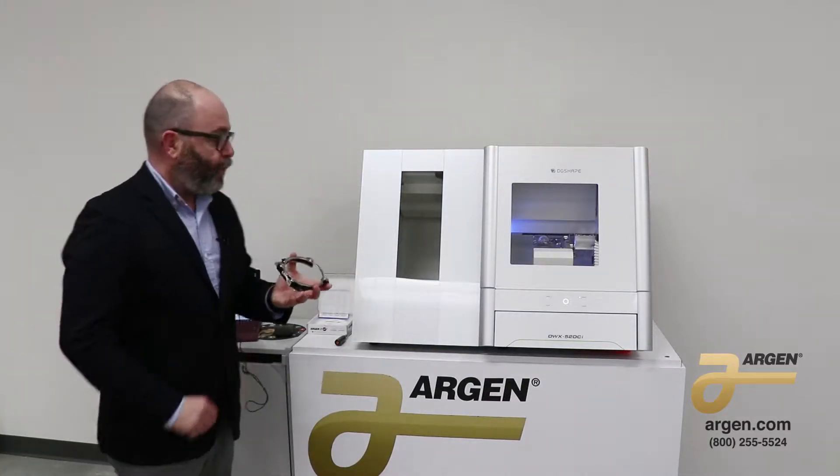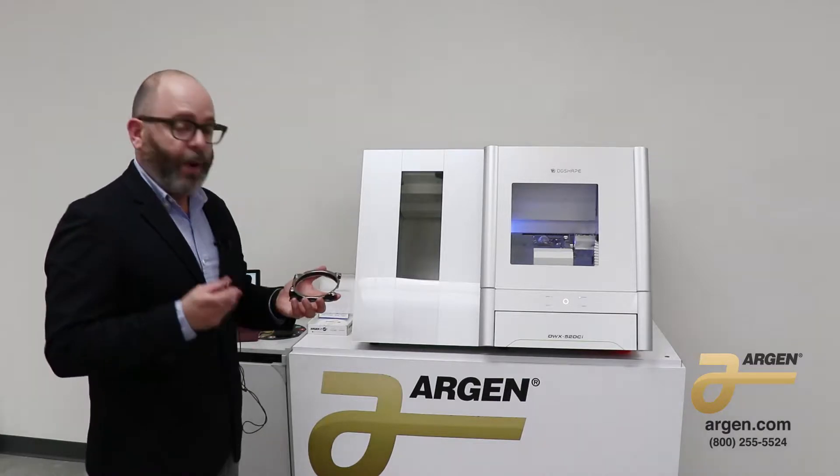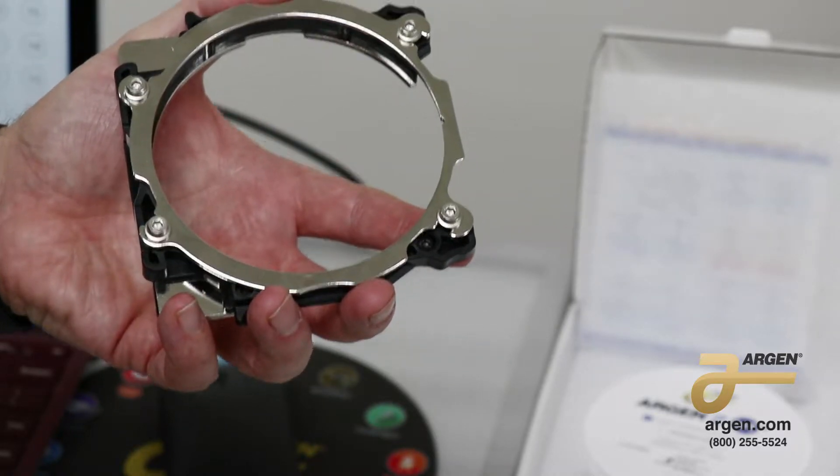This is the adapter clamp that comes with the Roland DWX52 series. I'm going to show you how to place the zirconia disc in properly. This is the only way how you should be putting a zirconia disc into this adapter.